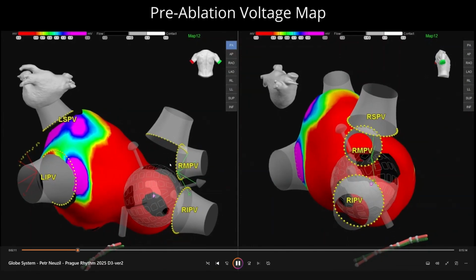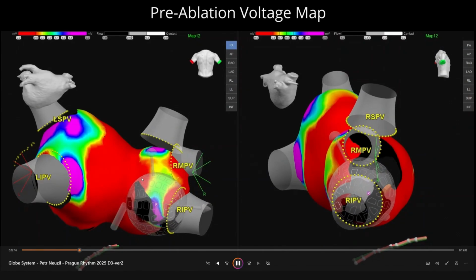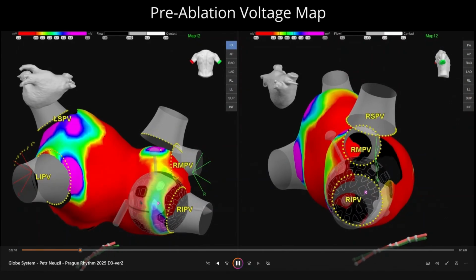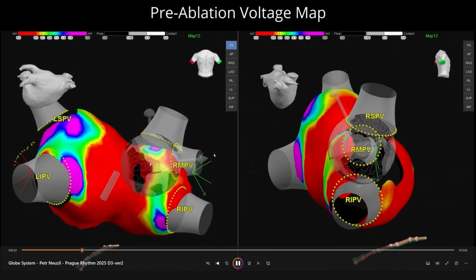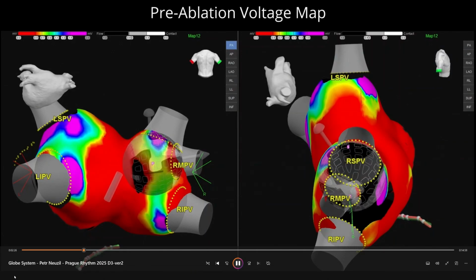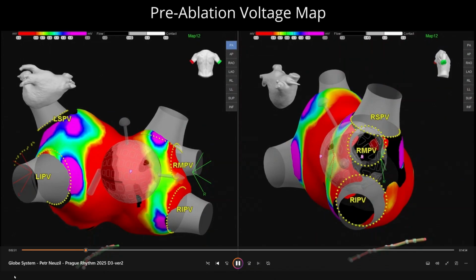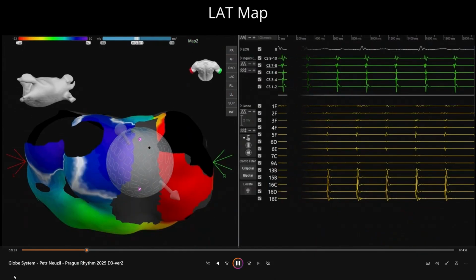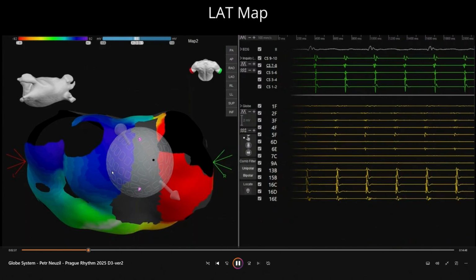Here you can see that we are able to indicate even the appendage orifice, and this arrow indicates the orientation. I didn't mention during the presentation, whenever you are facing with the globe, what is the axis? It doesn't need to be coaxial.